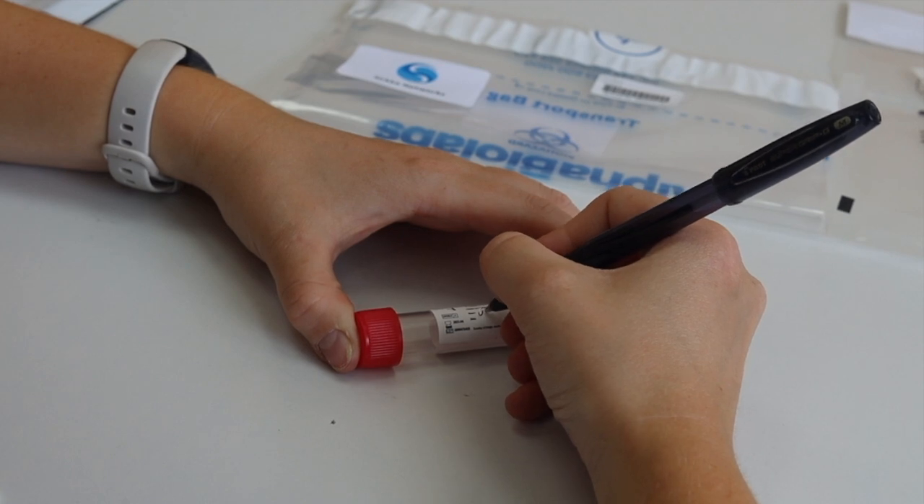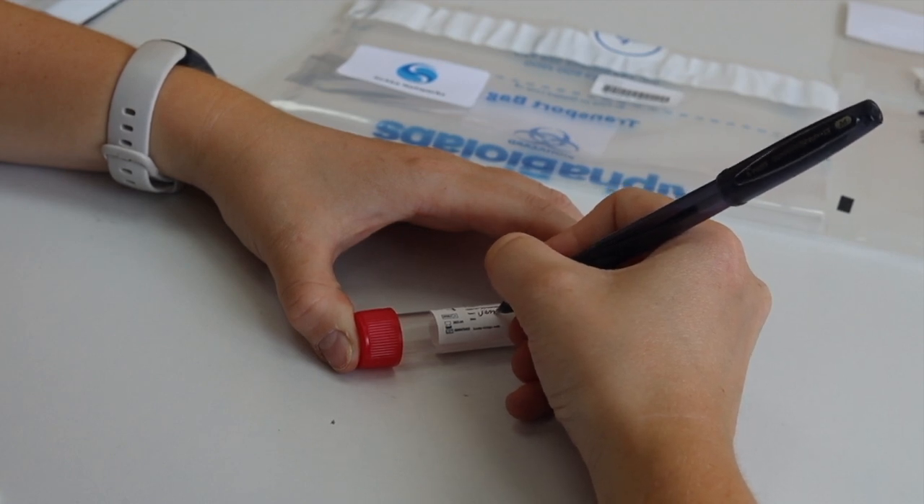First, write your name and test date on the sticker on the side of the plastic tube.